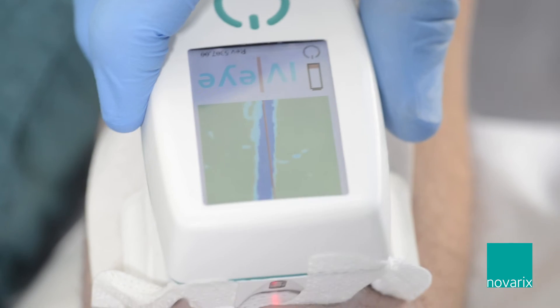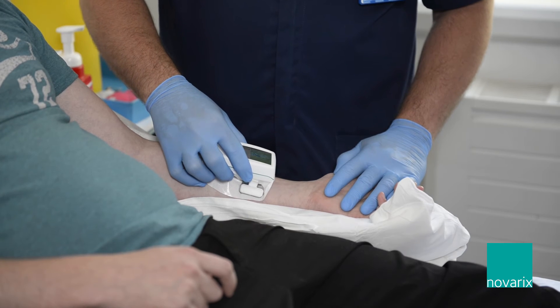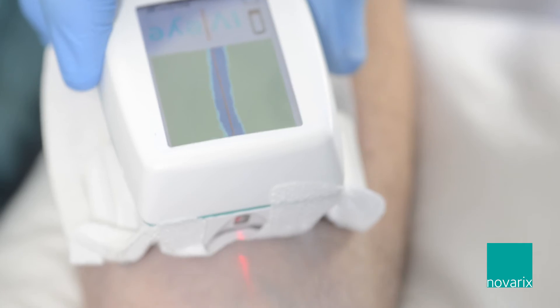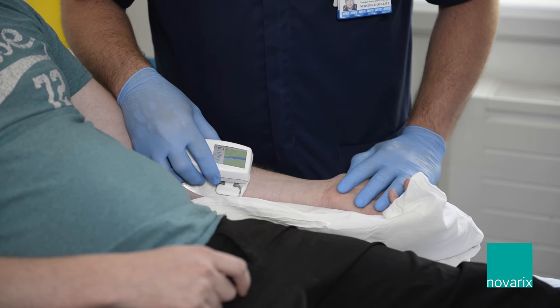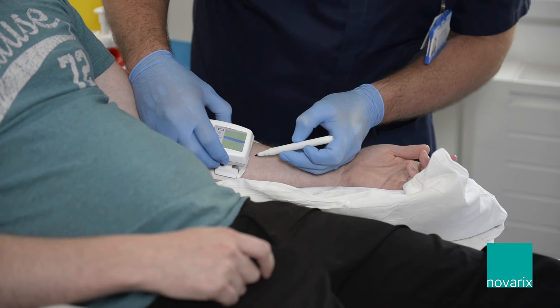When using the IVI, it makes the patient feel less anxious about the cannulation process and it enables the person cannulating to cannulate first time. The IVI is a great option for vessel assessment and it's really easy for staff to use. My top tip would be making sure you and the patient are comfortable during the assessment process.